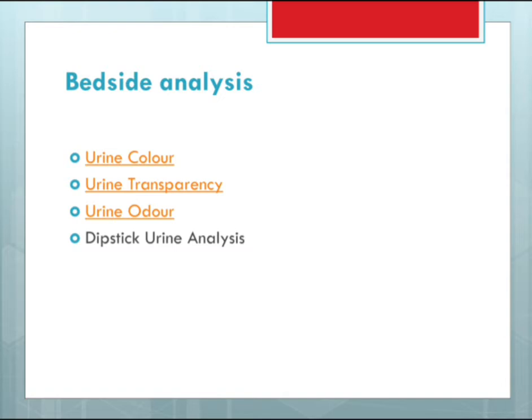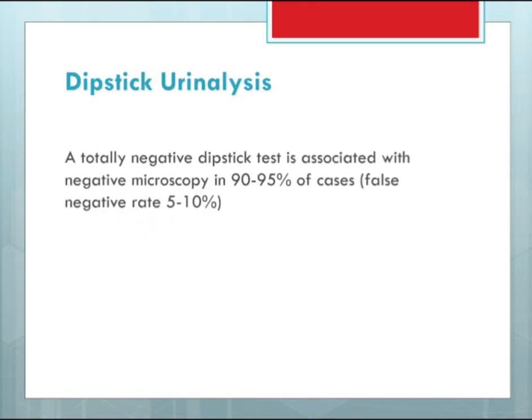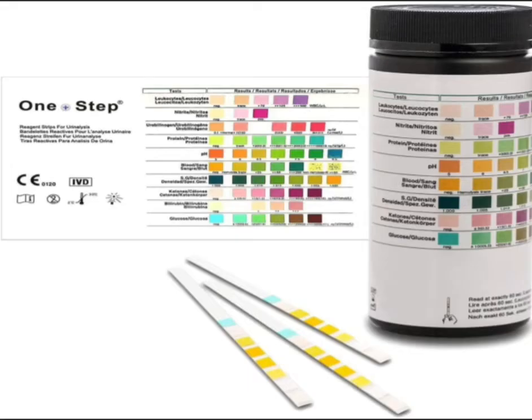Bedside analysis you can do includes urine color, urine transparency, urine odor, and a dipstick urinalysis. Dipstick urinalysis is our focus today. A totally negative dipstick test is associated with negative microscopy in 90 to 95% of cases. False negative rates are 5 to 10%.